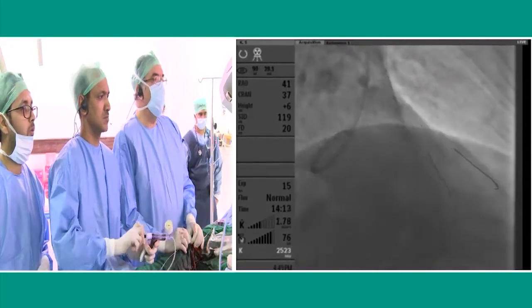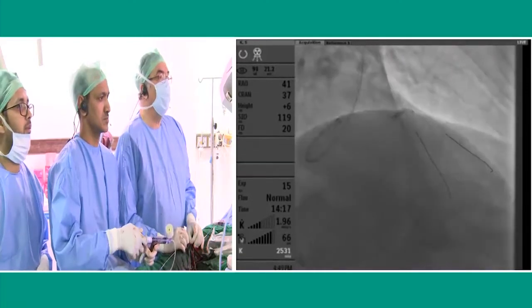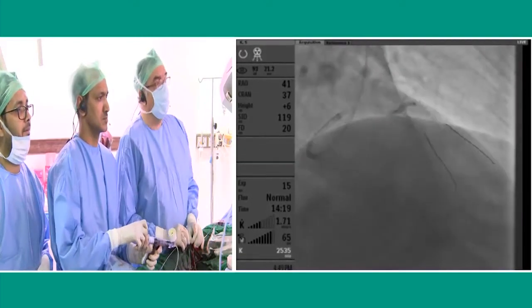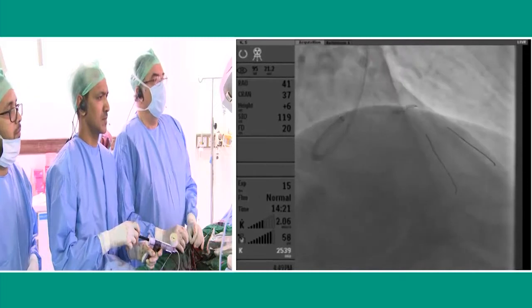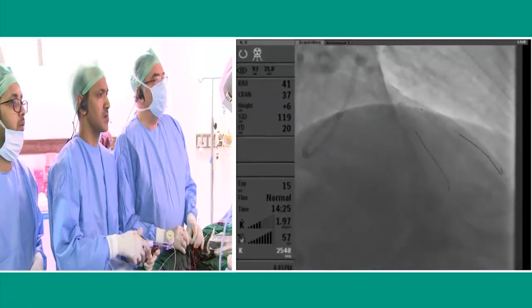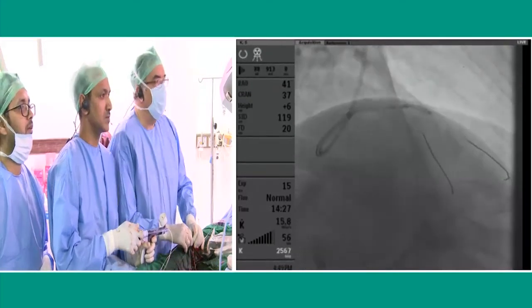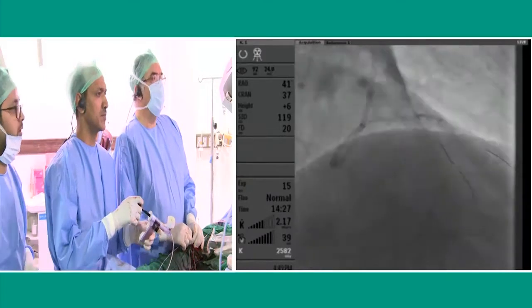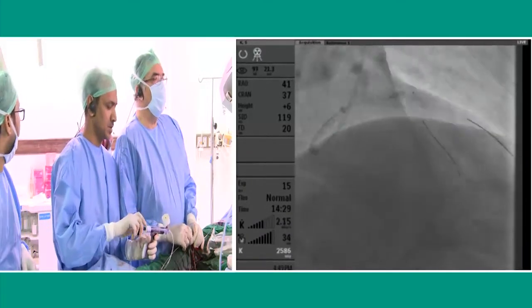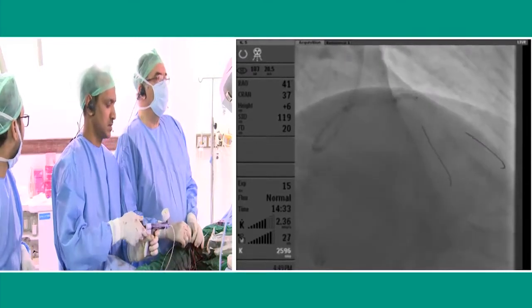Go on. 8, 10, 12. Keep quiet, sir. Everything should be finished in a few minutes. Stop. We advance a little bit more. Here, 6. 8, 10. Stop. One more time. Which stent do you want? 8, 10. Stent, which one? 10, 12, 14. Stop, deflation.